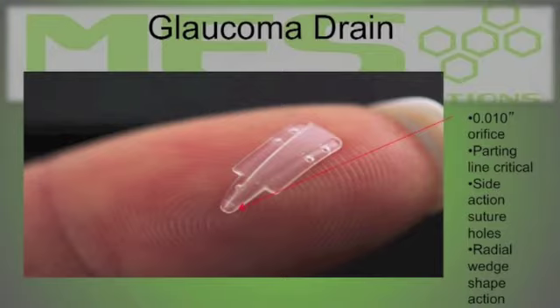This is again a glaucoma drain. This goes in the side of the sclera of the eye, and the orifice at the end is a 10/1000 inch diameter hole, and this whole part kind of acts like a venturi system, so it actually works with pressure to pull the gunk from glaucoma to drain behind the eye.